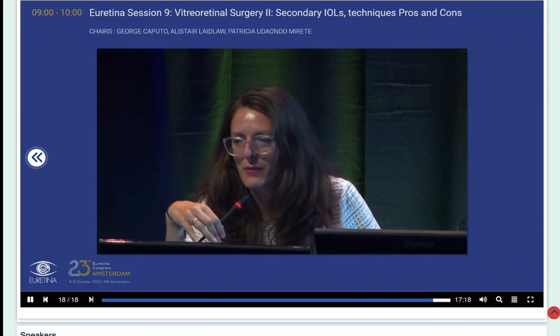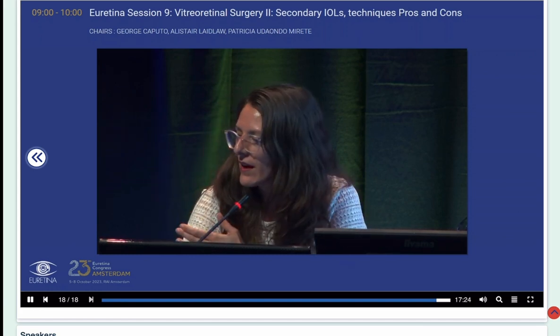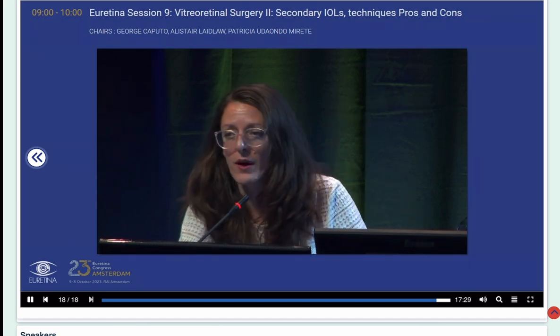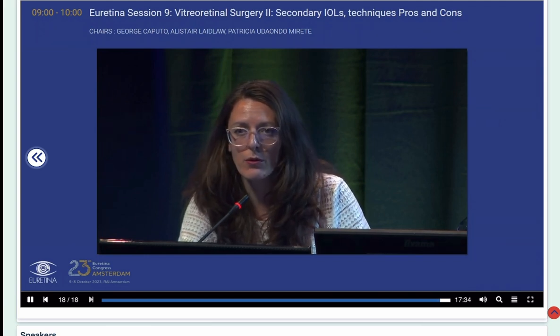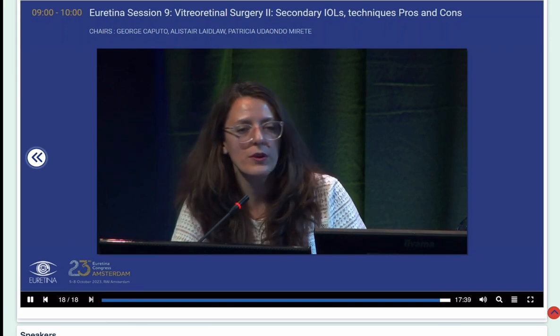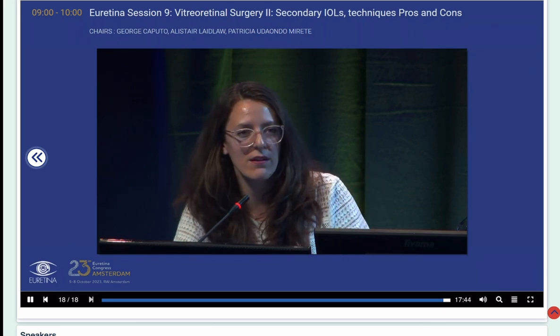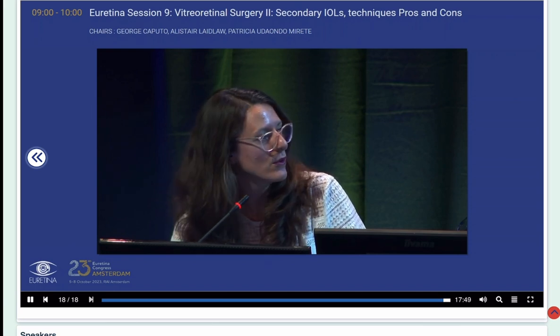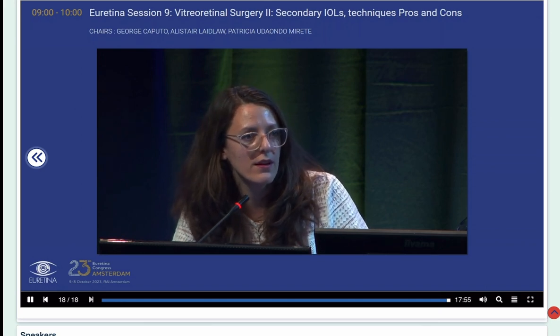You had a couple of other comments. Yeah, I would like to ask, actually, all of you. The problem is also we are talking here, I ask Kai, he has Carlevale, all the dioptries in his OR, we don't. It's about the needles, but I think we need to know what is available, so that's why Carlevale has also a cost. So we need to consider everything. I don't think everybody here has Carlevale lens Gore-Tex in the OR. So that's why also the using of 3-piece IOL intrascleral could be useful if you don't have anything else.